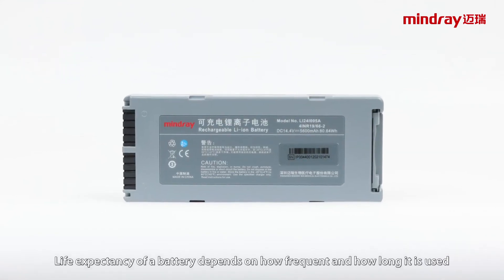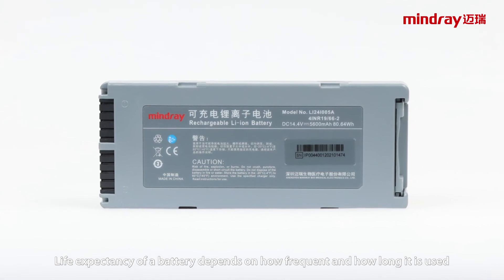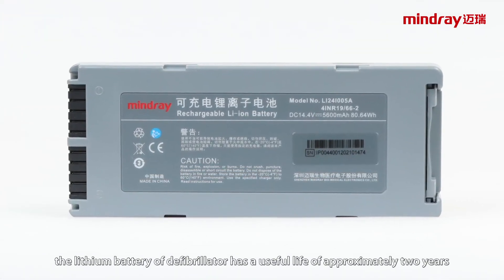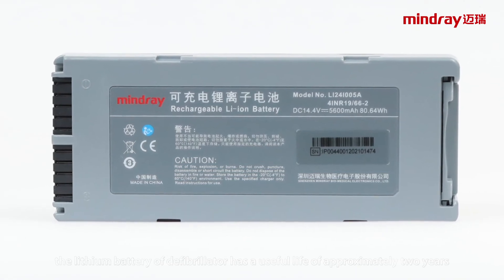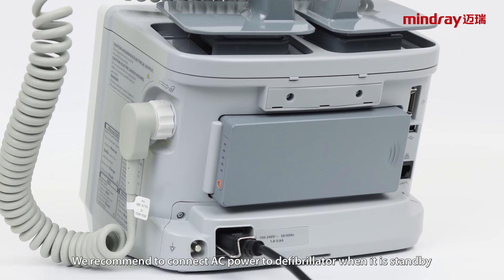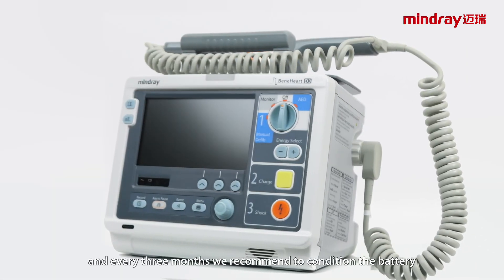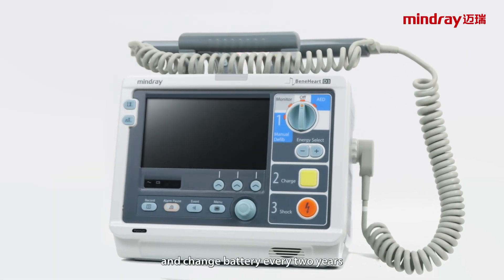Life expectancy of a battery depends on how frequent and how long it is used. When properly used, the lithium battery of the defibrillator has a useful life of approximately 2 years. We recommend connecting AC power to the defibrillator when it is on standby. Every 3 months we recommend conditioning the battery, and change the battery every 2 years.